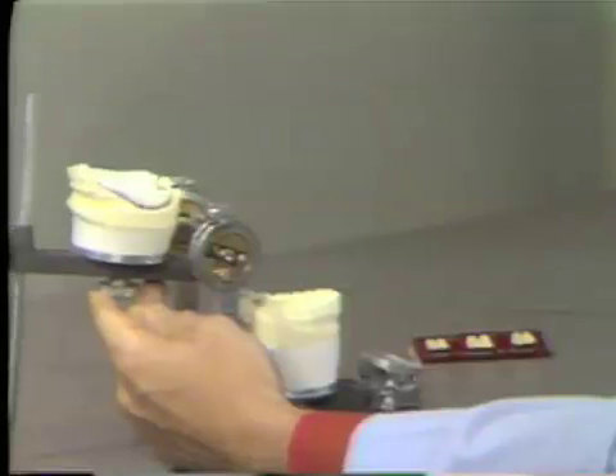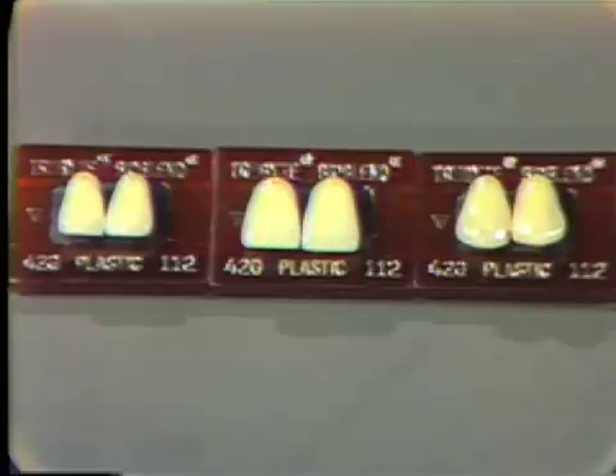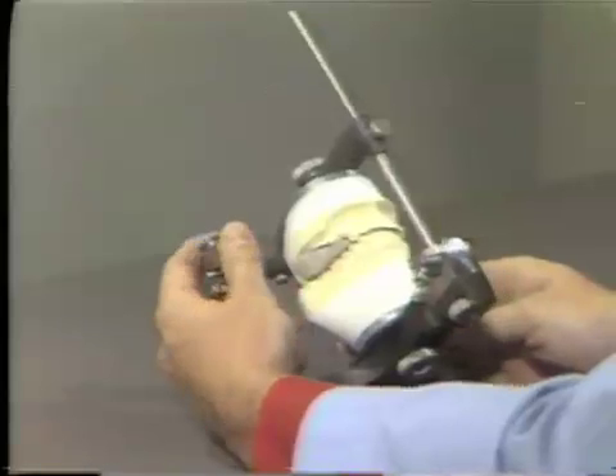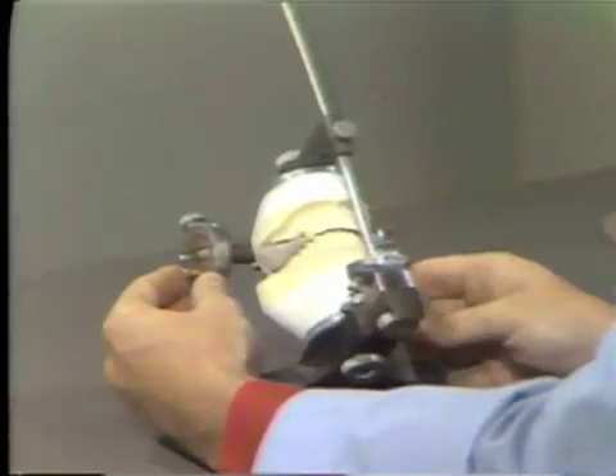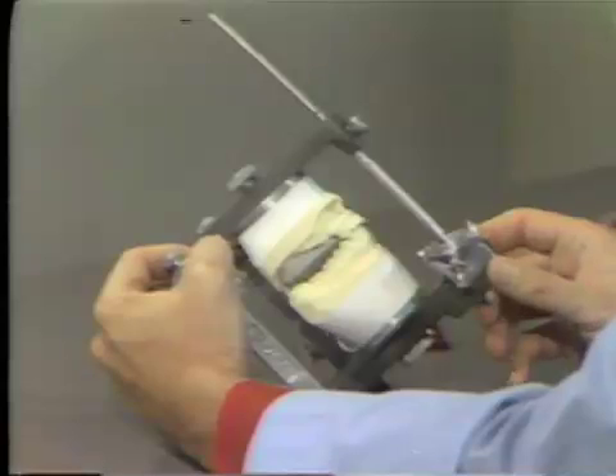The anterior teeth we are going to use for this exercise are TrueBite BioBlend 42G Shade 112 plastic anteriors. This particular mold and shade is as close a replica to the patient's teeth as was possible. Setting the anterior teeth for an immediate denture allows us to duplicate as closely as possible the anterior arrangement of the patient's natural teeth, or to change that setup if the patient desires a different look to his anterior teeth.